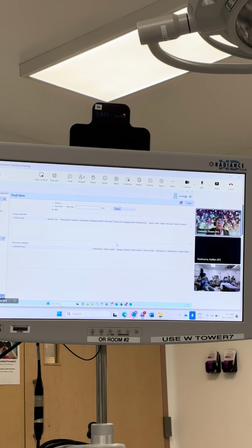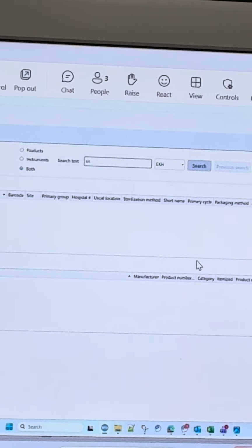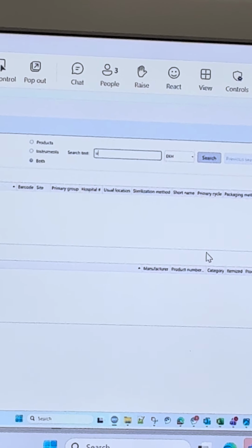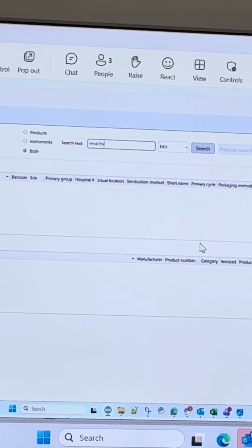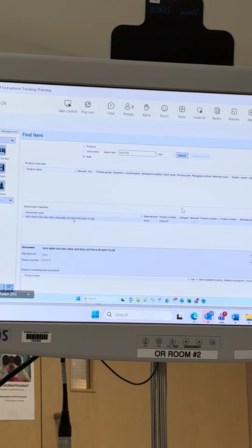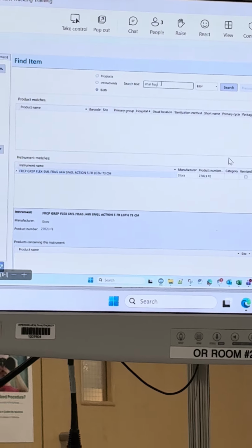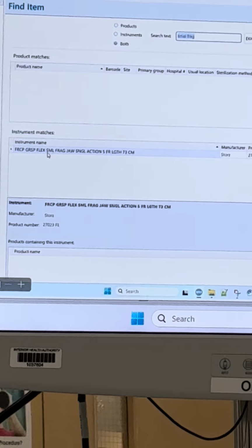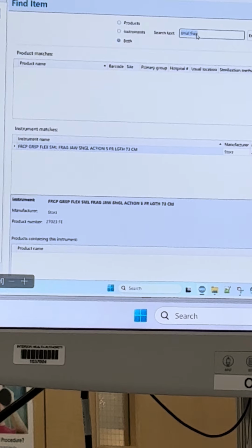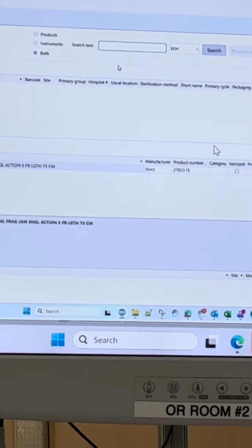What's the name of the set? USF. Universal Small Frame? Small frag. Sure. Okay, not a set name. What I typed just matches in the instrument. For sure. If you have an idea of the name, try USF.